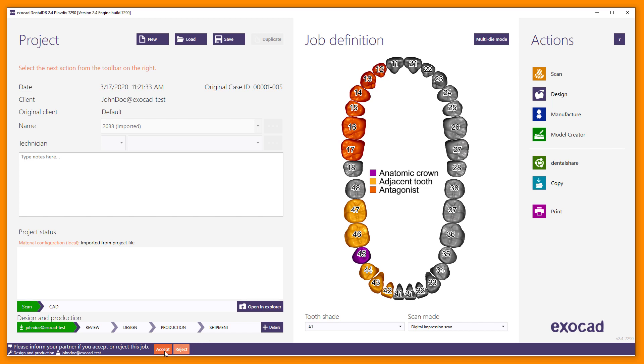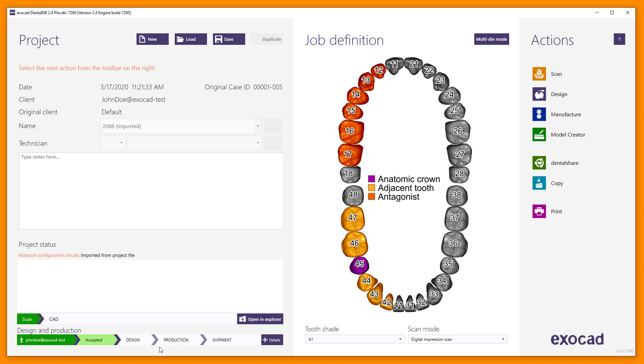As a recipient, you can accept or reject a job. Once you have accepted the job, the sender will be notified and the Review field in the status bar of the sender and recipient will change to Accepted with a light green background.